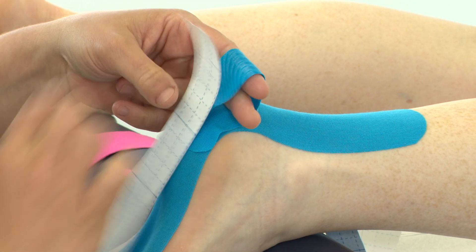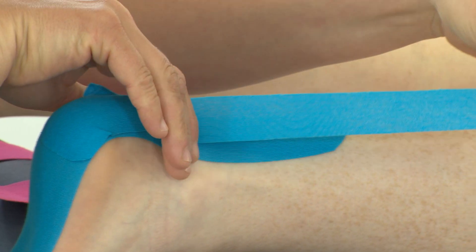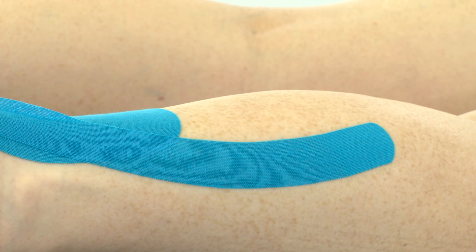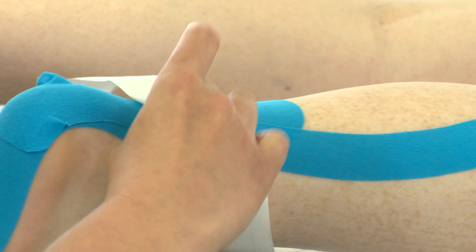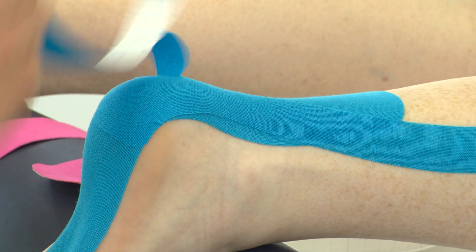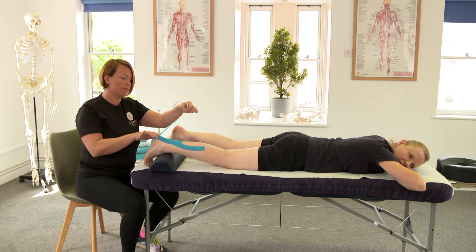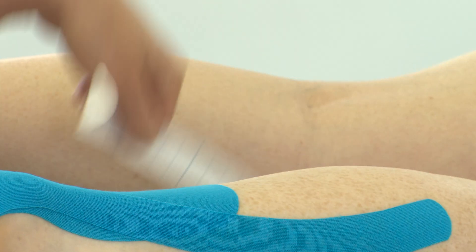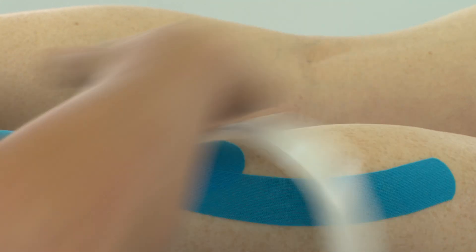Pull the tape and this releases the backing. Hold the anchor. Apply 50% stretch up towards the lateral head of the gastroc and again no stretch on the anchor. Use the back of the tape to ensure you've got all of the tape stuck to the skin, and then repeat on the other side. Remember, pulling the tape releases the backing strip. Fold over so we have no stretch on the anchor, then some stretch up the medial head of the gastroc, no stretch on the anchor, and use the backing to ensure all of the tape is stuck down.